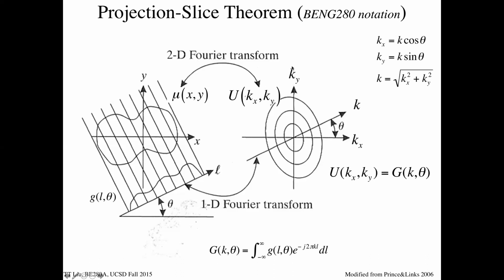And then our Fourier space, and this will be true for MRI as well, will be k sub x, k sub y. So this is cycles per millimeter in the X direction, cycles per millimeter in the Y direction, and then across at 45 degrees would be cycles per millimeter in the 45-degree plane wave direction, right?